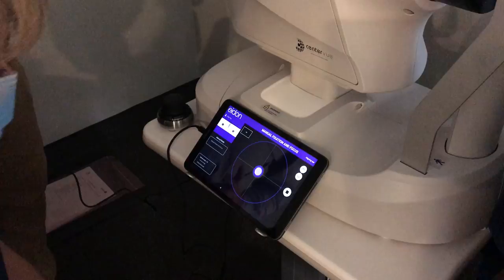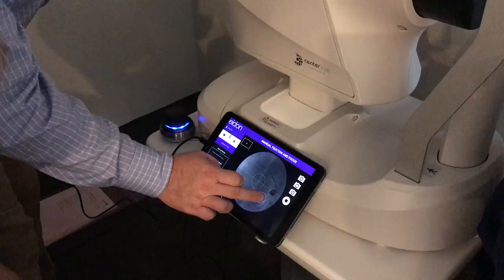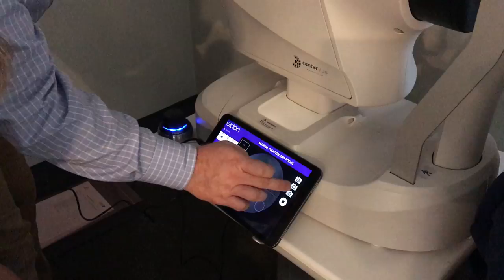And then I'm going to instruct the patient. Do you see the light right now? Now follow that light. We're going to go out as far as we can to the periphery. Now keep on following that direction — go past the light. And I'm going to take a picture right now.